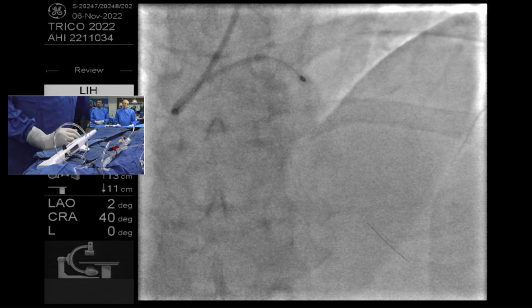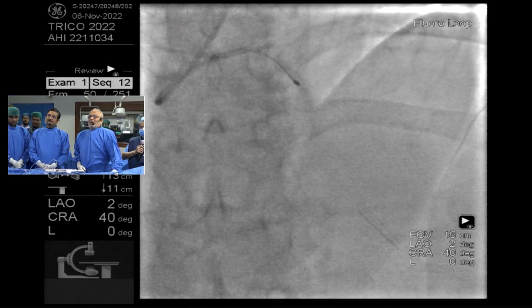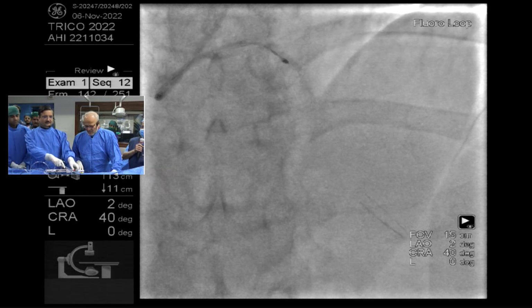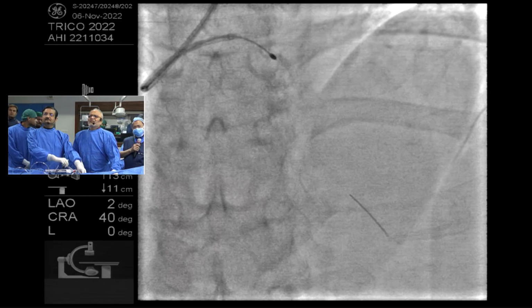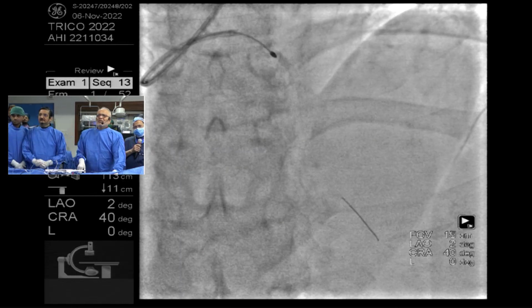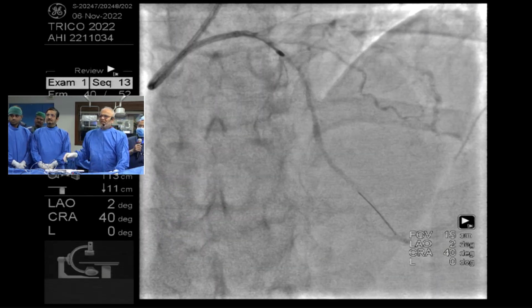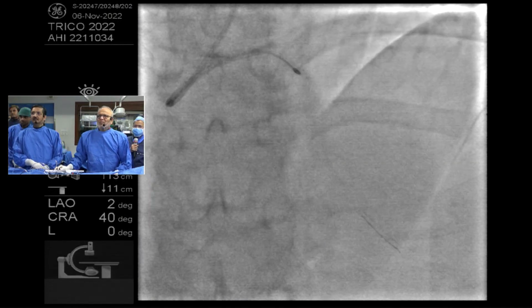Do you flush with contrast in between, or you don't do that now? I don't think it will be helpful, but let us see. It was the original recommendation. The slow flow started, yeah. But I think the flow was down even from the beginning, so it'll be okay.